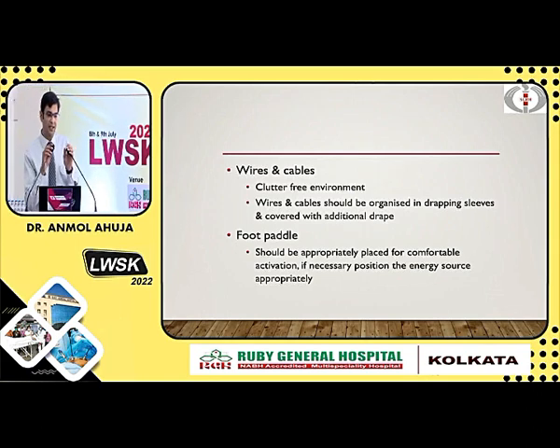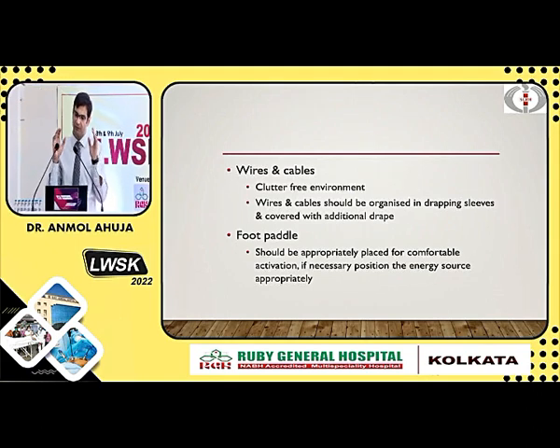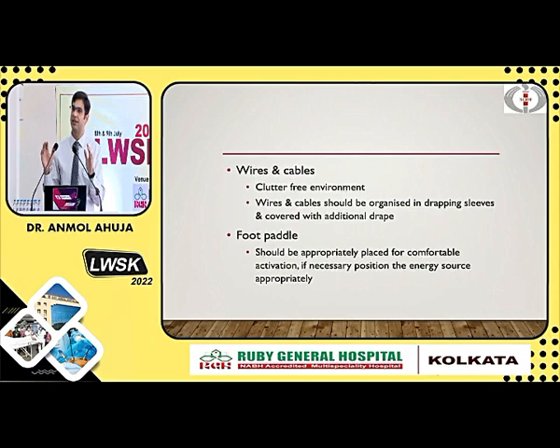Other thing important is, if you are performing a longer duration surgery, take a break. Take a break. Move around a little here and there. Take your eyes away from the screen. It's not a marathon race that we have to finish on time. So there is no limit for the time.